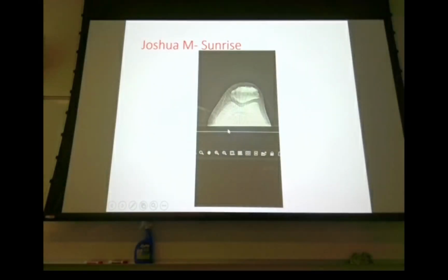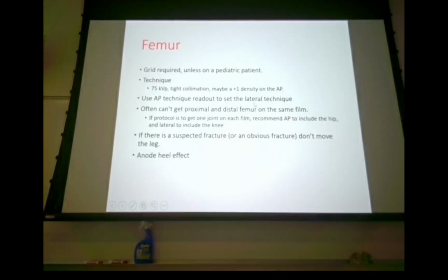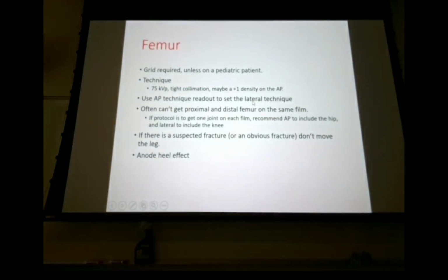Very cool. And Josh with Sunrise, did you have any patient information on this one? He was getting a knee replacement. Oh yeah. Okay, that's just a pre-op. Well, the difference in the appearance of the anterior versus the posterior portion of the knee is kind of weird. You got a distinct line of demarcation here where you've got very dense versus not quite as dense. So, anyway, we'll pick up there next week.